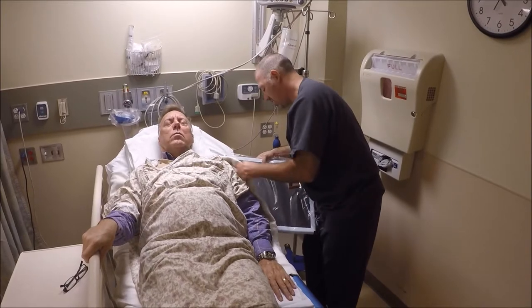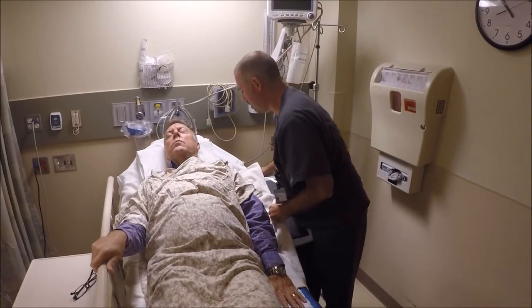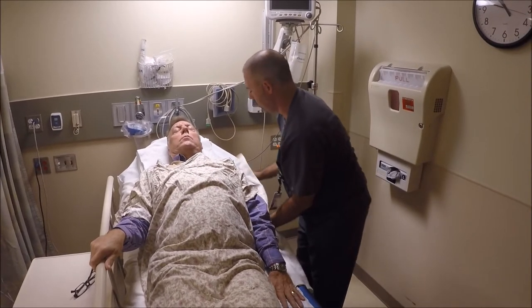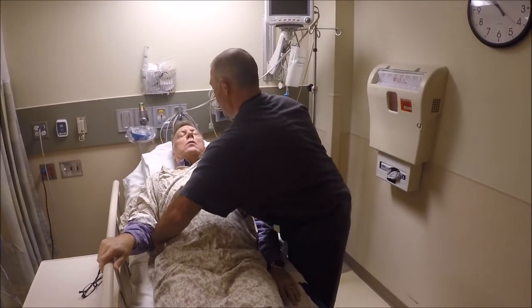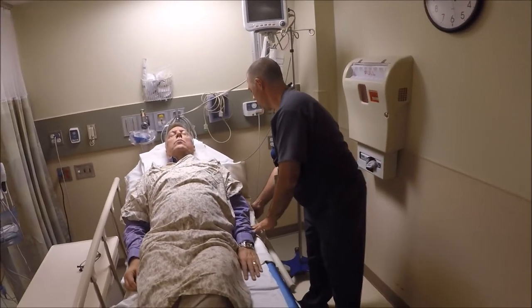We're going to get between it and the sheet. I'm just going to get that started here. Here we go. And then it's going to come right on through. Try to go as easy as I can. I'm just going to feel around the board, make sure we have it right where we need it. That actually looks pretty good. I'll know more when I get the X-ray tube in position.